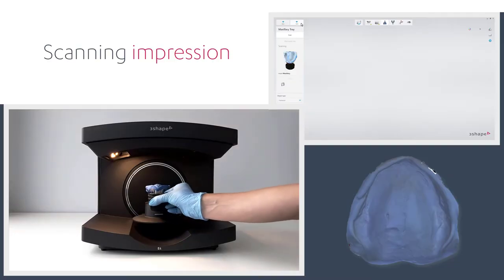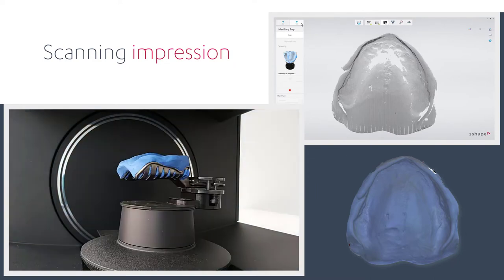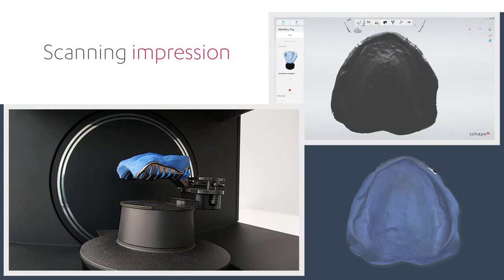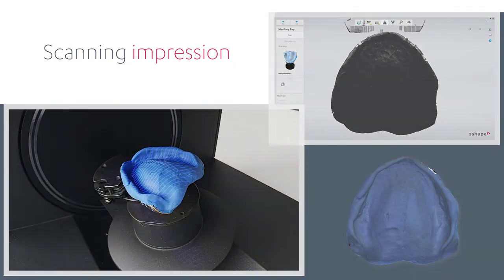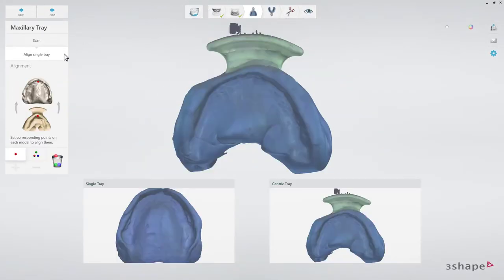Now insert and scan a maxillary single tray. When it's finished, align the single tray to the Centric Tray. When that's done, click Next.